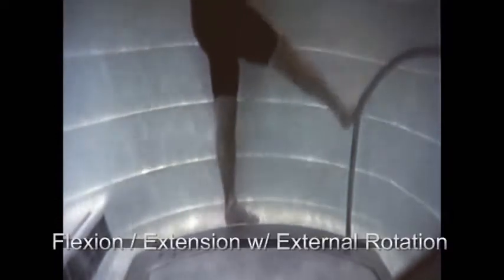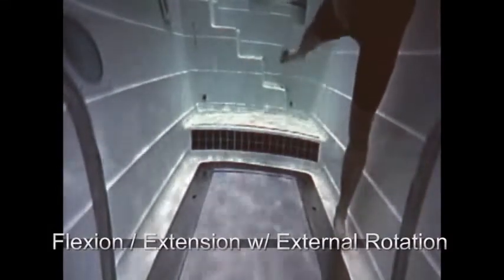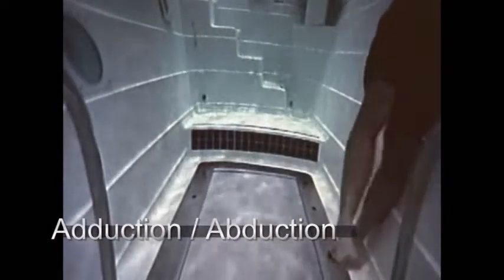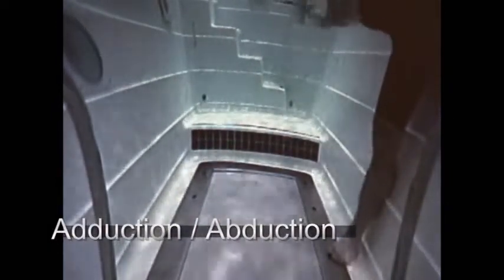So we're doing flexion and extension, and here's flexion extension with a little bit of external rotation of the hip. There again, I'm focusing more so on groin-type injuries — very hockey specific — making sure the adductors and abductors and extensions are working together, but right now just trying to keep a normal plane of movement. Moving to the side here, working on adduction and abduction, but basically just focusing on the one — the injured leg. Normally I try to use both legs, so you're doing stabilization with the injured leg as well.